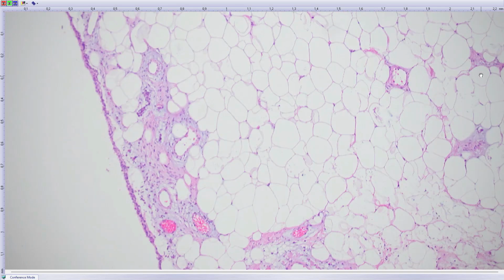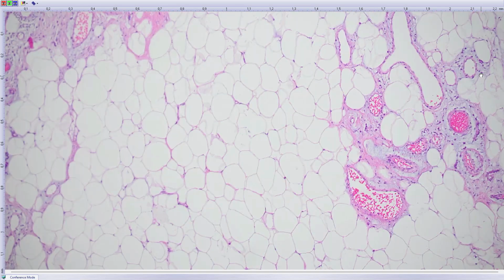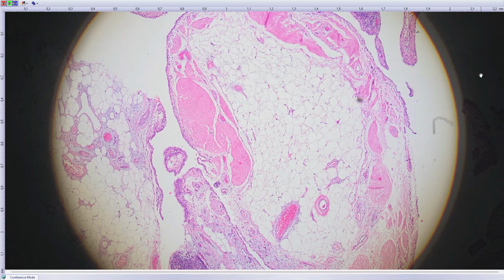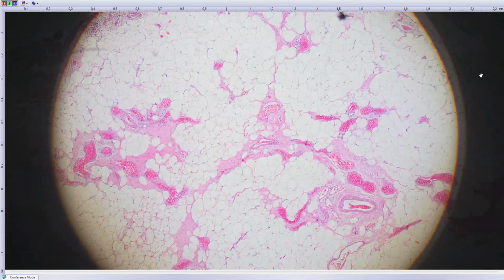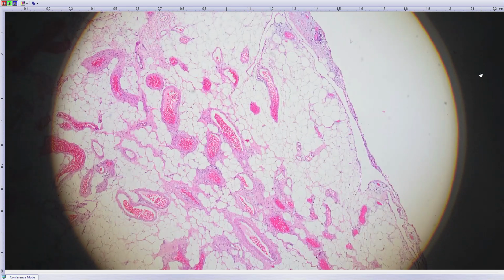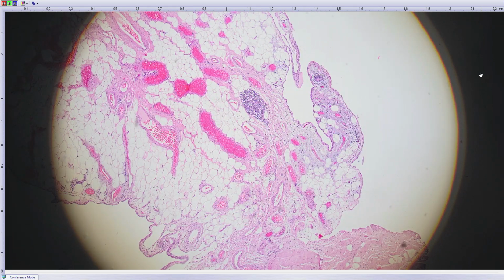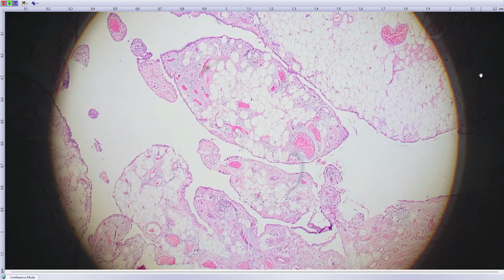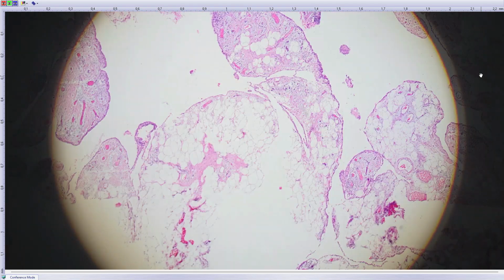What is important here? There's a lot of fat tissue in the synovial fronds, so much of it. This is clearly abnormal, and it's diffusely present. Almost in every slide, you have this fat tissue in the synovium, and this is called either synovial lipoma or, more commonly, lipoma arborescens, because it creates this arborizing synovium, which is enlarged, hyperplastic. And typically in patients with osteoarthritis, and very often it's bilateral.